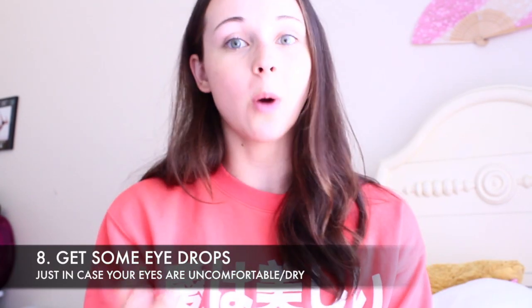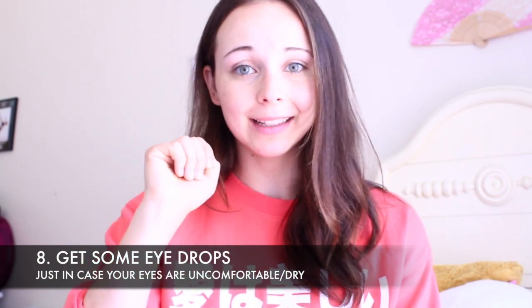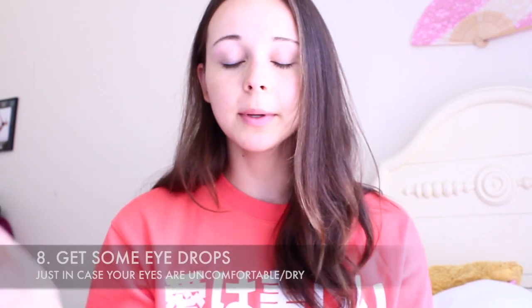Another tip is to always bring some eye drops with you. There are some eye drops that are perfect for dry contact lenses. If your eyes are feeling uncomfortable, you can just get your eye drops out and squeeze them in, and then it'll feel a lot better. Because sometimes contact lenses can get dry. So things to keep with you, these eye drops and some solution. A little thing, maybe that big.